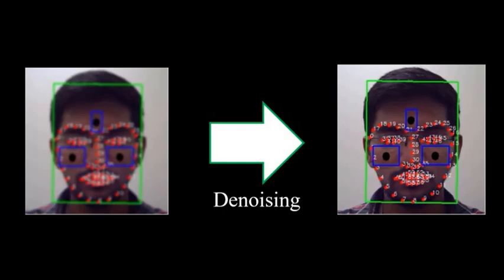Step 2. Blur detection, denoising, and motion capture. To estimate heart rate with high accuracy, motion blur-free frames are required, for which, by using the initial few frames as reference, we calculate the blurriness of every other frame using second-order Laplacian responses. Setting the responses from the reference frame as threshold, motion blur-free frames continue to get processed, while the other frames undergo denoising to reduce motion blur.